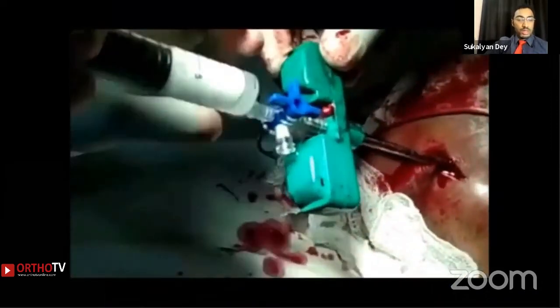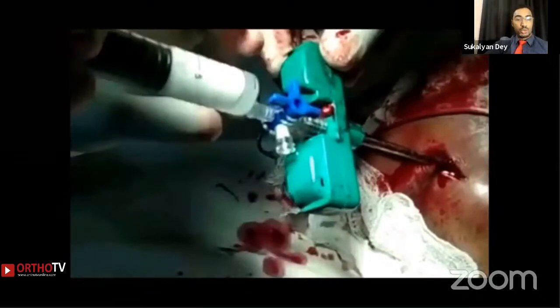Once the sclerogen is injected, it is injected at a rate slow enough to prevent spillover, and which is usually over a few minutes. Once the injection is completed, the syringe is kept in situ for about a few more minutes in order to prevent the backflow of the fluid into the open wound.